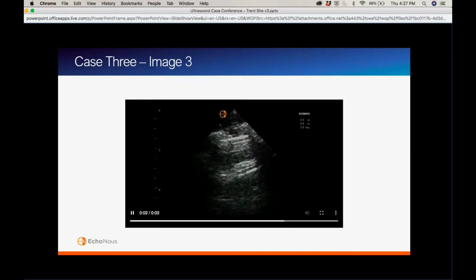So this is the interesting thing about ultrasounds, that sometimes it can really just help clear up a very, very clouded picture when there's so many diagnoses, and then it allows you to go back to the patient, start from the beginning, and say, what are the obvious truths that we have in front of us? And the biggest one was that you had lung sliding. I'm sorry, you had lung noises when you auscultated.